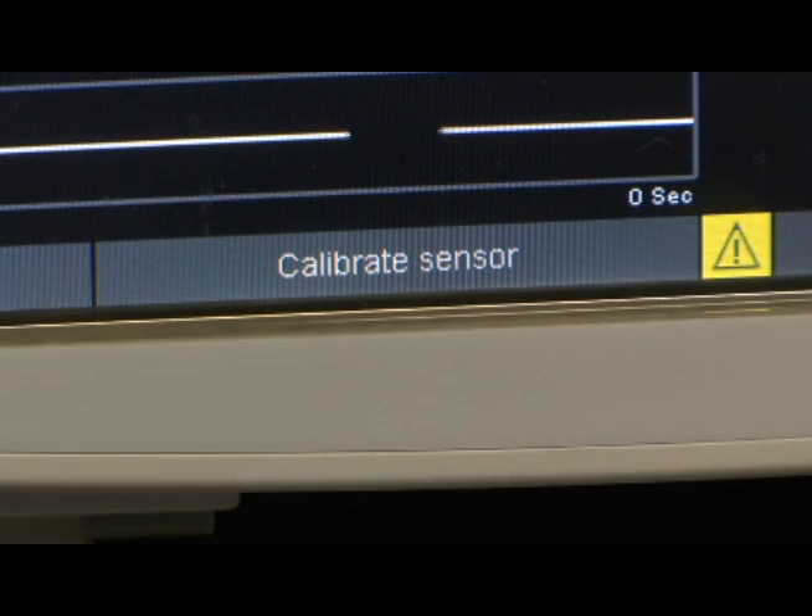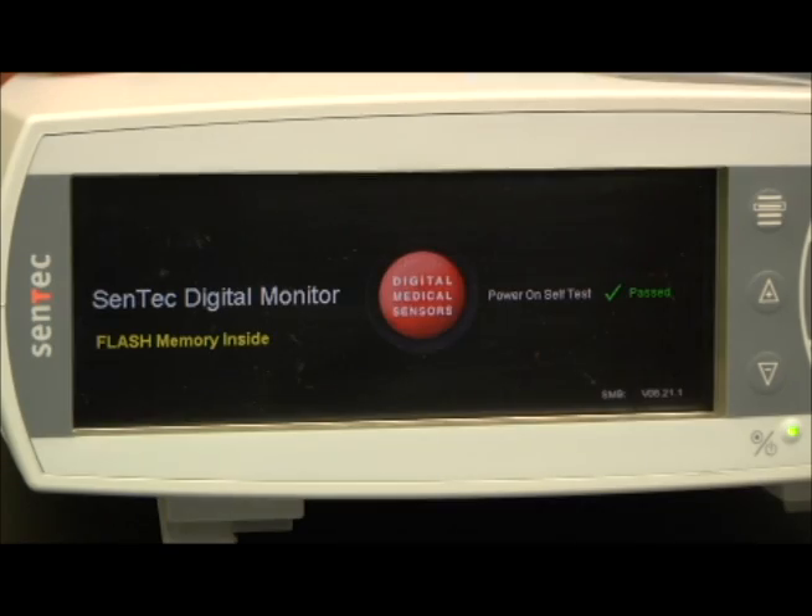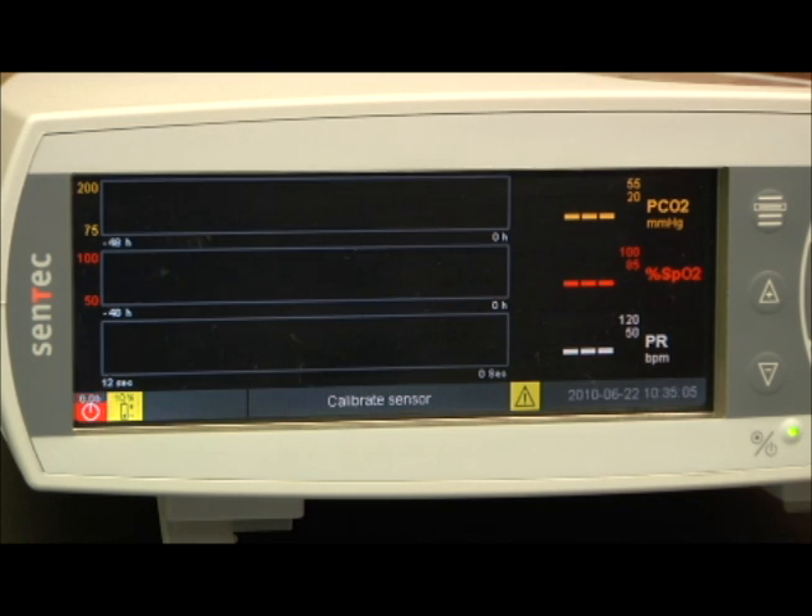The digital electrode requires periodic calibration as displayed in the status bar window. When the unit is powered up, the Centec monitor will indicate that a calibration is necessary. This initial calibration should take between 3 to 5 minutes and will be adequate for the first 4 hours of monitoring unless prompted by the monitor.